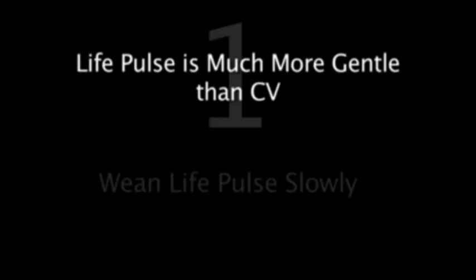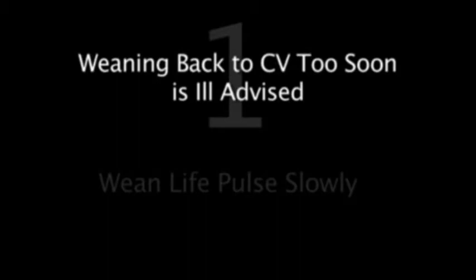Wean the LifePulse slowly. The LifePulse is a very gentle form of ventilation, much more so than conventional ventilation. Therefore, weaning the patient back to conventional ventilation too soon is ill-advised.